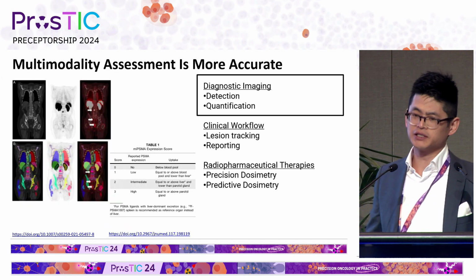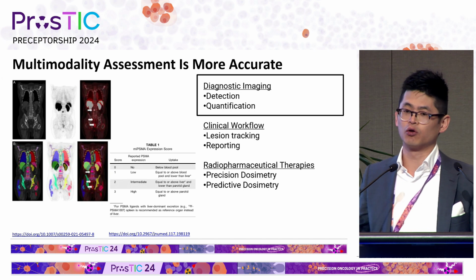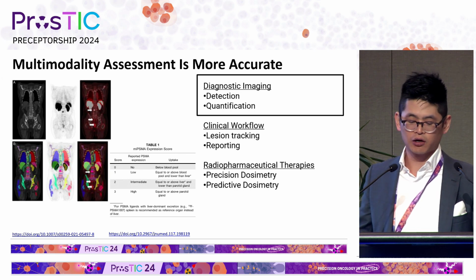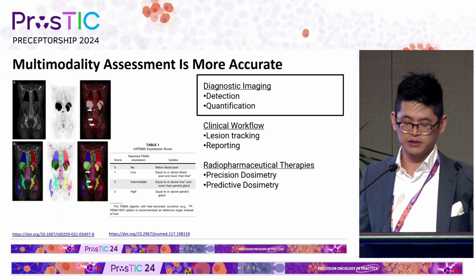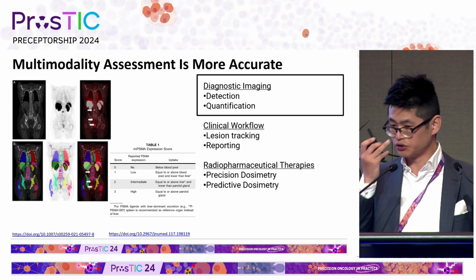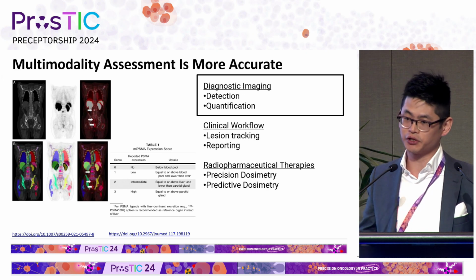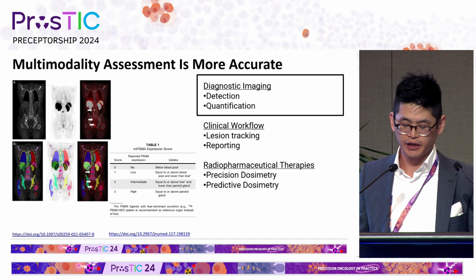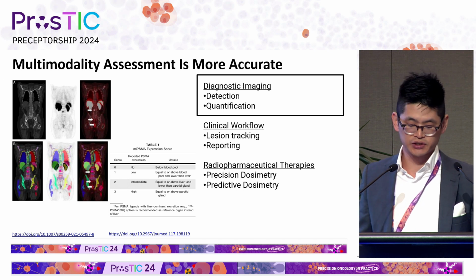And combining CT with PET helps us with clinical localization. Similarly, then, for these automated algorithms, segmenting out the normal organ in CT allows us to compare that then with the automated tumor localization on the PET scan. And this is a result from an older publication in 2022 using the PROMISE criteria for PET and showed an automated algorithm sensitivity of lesion detection and localization of over 87%.